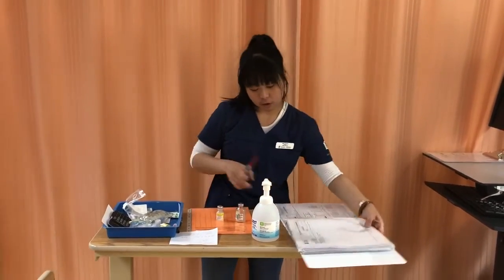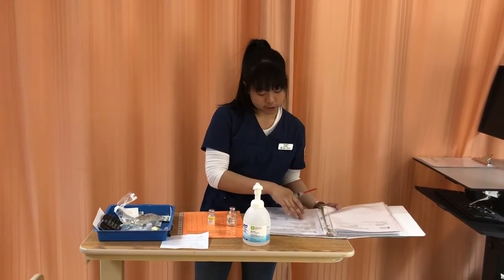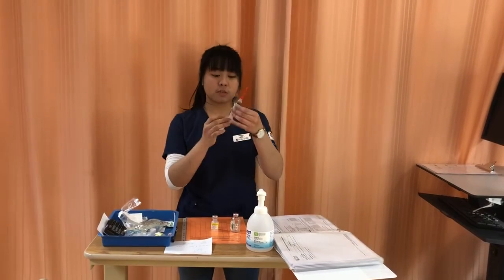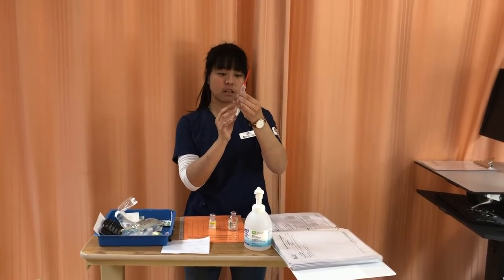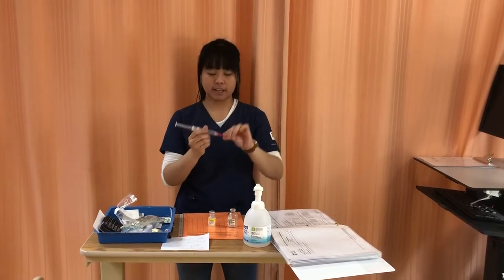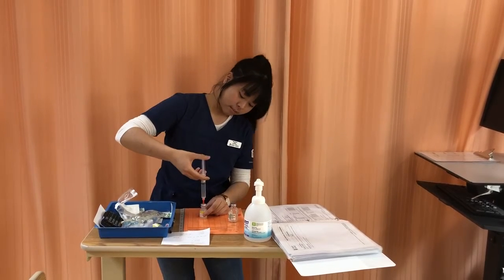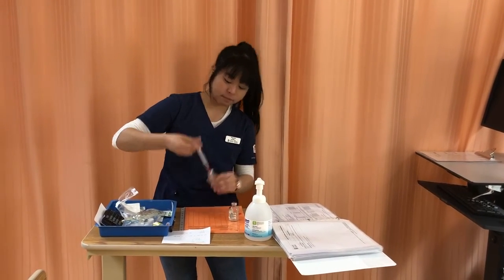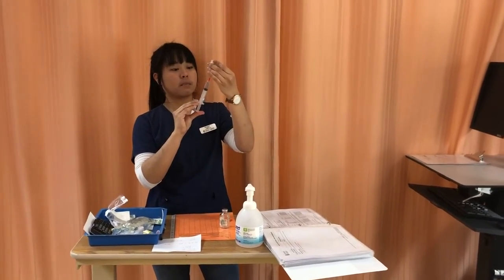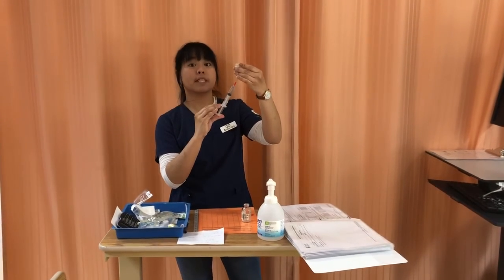And then, according to our reconstitution instruction here, 5 million units, I need to administer 8.2 mLs of normal saline. So I'm just gonna do that. So 8.2. Okay, I just got my air in there. And then I didn't touch the lid, so we're good to inject my air for my normal saline and take out 8.2 mLs. And I'm doing this while maintaining sterility.